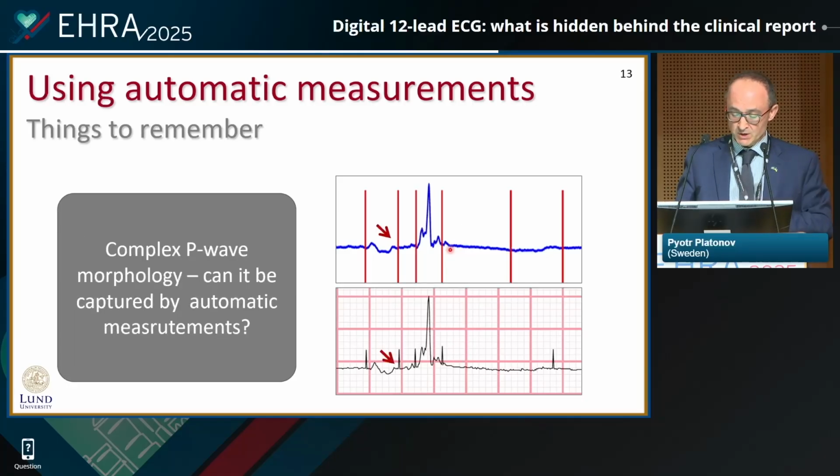If we look at the P wave in the same patient, you also see it's not really a healthy P wave here, right? So it's not even biphasic. It goes up and goes down and then goes up again here. And morphology algorithms are made for some sort of standard morphologies that are expected. The farther we are from the standard, the more difficult it could be for the computer to measure. It's worth looking at ECGs as well. Again, if it's a smaller size, look at them. If it's 1 million ECGs, we have to live with that. So it's sort of the counterbalance of the numbers.